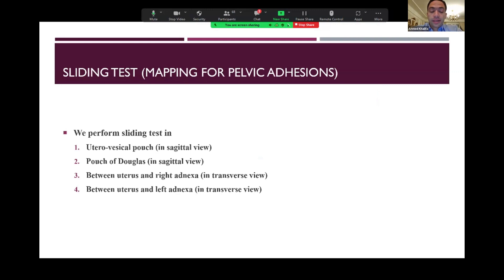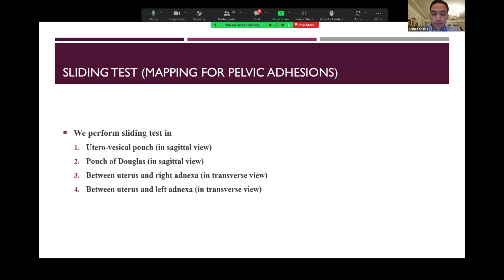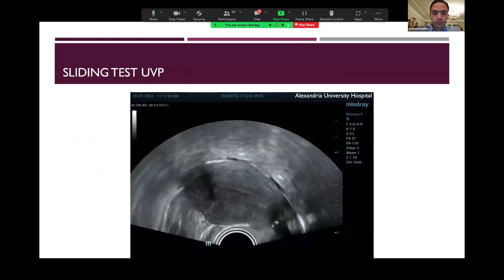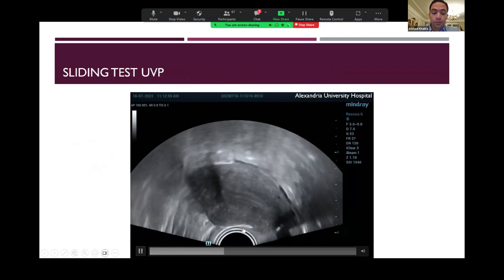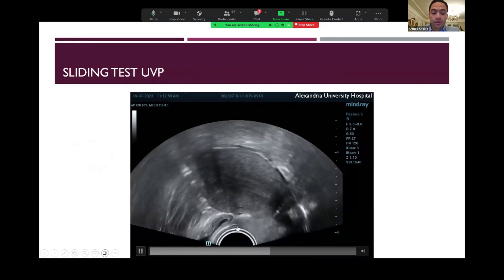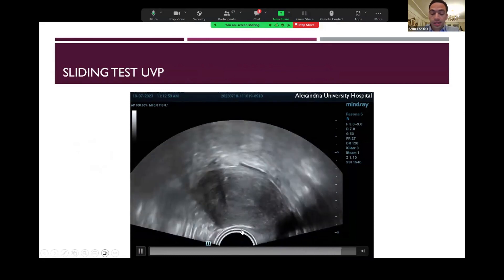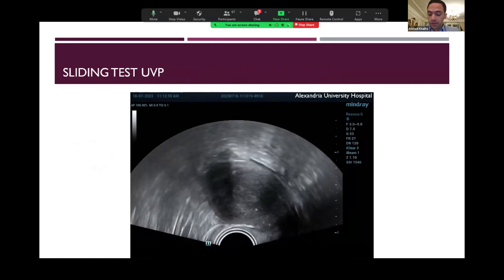We will test the sliding and the relation of different organs of the pelvis to each other, checking for any adhesions between them. We will check the utero-vesical pouch first and the pouch of Douglas, which is divided into an upper part and lower part. We will also check the relation between the uterus and the adnexia on both sides. Firstly, checking the utero-vesical pouch by pressing the probe in the anterior fornix against the uterus — the bladder can slide freely — means there are no adhesions or signs of deep endometriotic lesions between the uterus and the bladder.